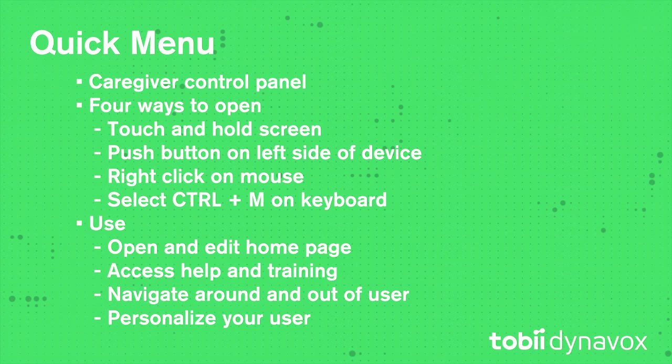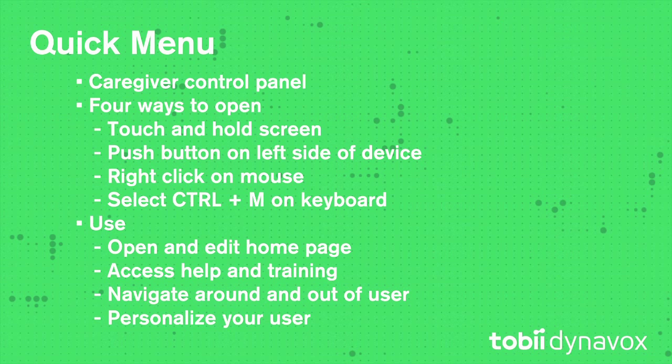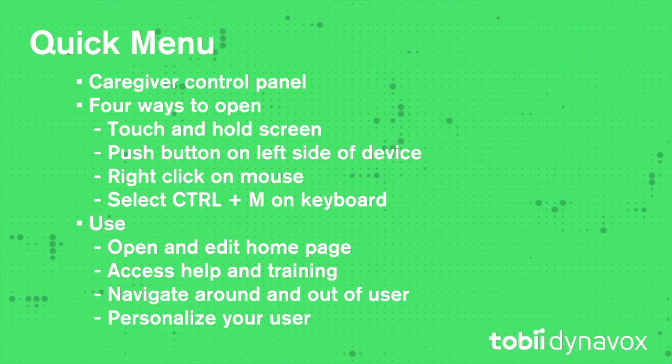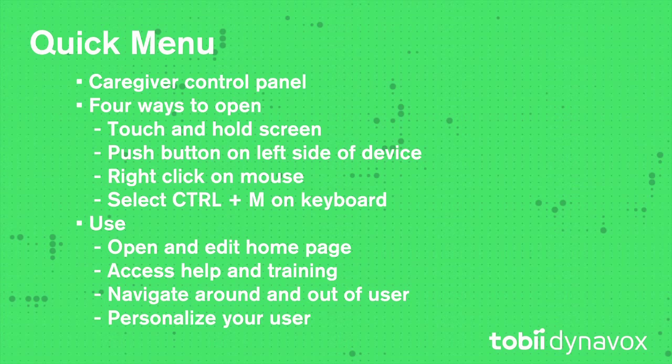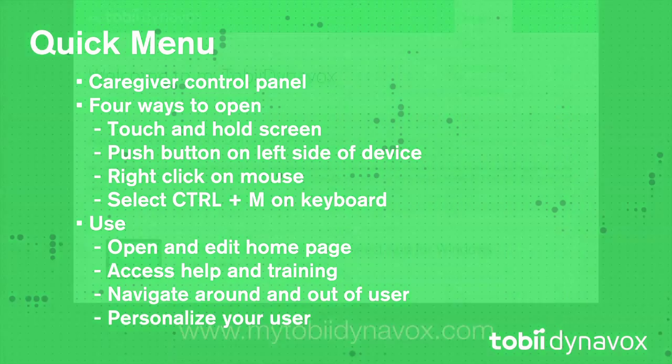Let's review. The Quick Menu is the Caregiver Control Panel. There are four ways to get to it. Open the Quick Menu to get to and edit your home page, access the Help and Training, navigate around or out of your user, and personalize your user.